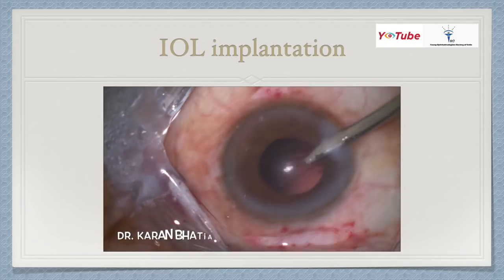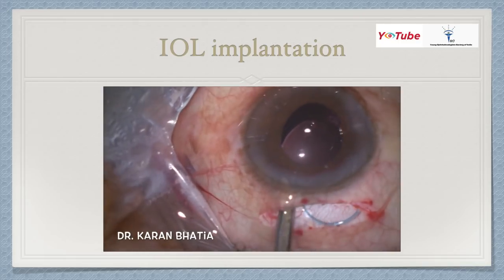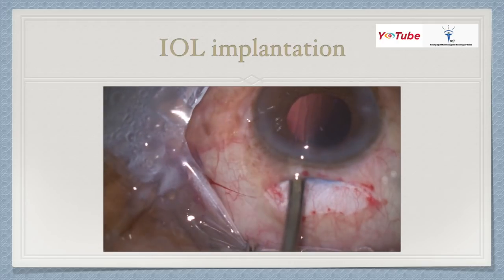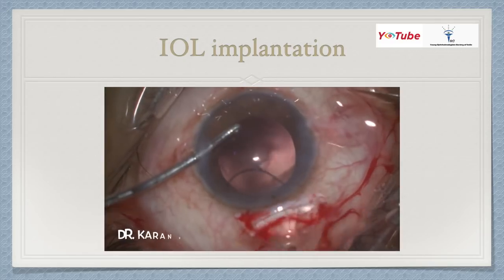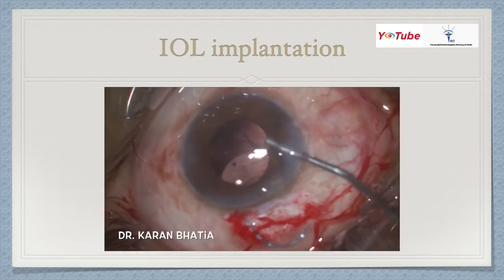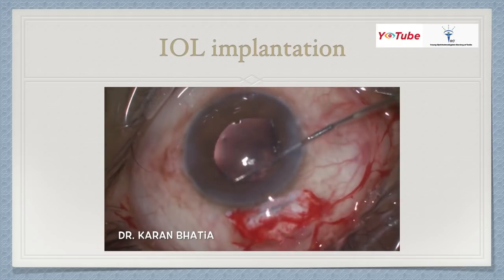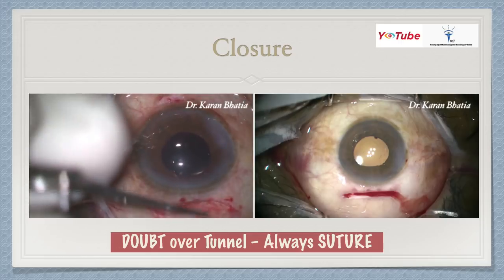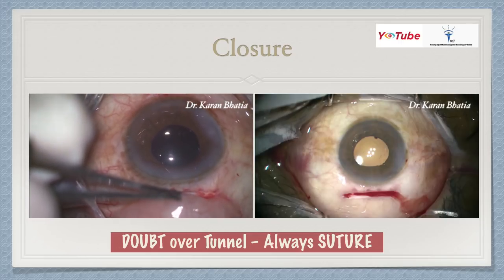In another video, using a Simcoe cannula as an AC maintainer, if there's difficulty placing the IOL, use the dialer hook at the holes or the optic-haptic junction to guide it into the bag. Using the irrigation part of a bimanual IA apparatus, if there's difficulty, always inject OVD inside — it makes surgery so much easier. For initial cases, always do IOL implantation under viscoelastic. If the AC is shallow, inject viscoelastic again — there's no harm in doing so repeatedly. Remember: you can work comfortably in a deep anterior chamber, but a shallow anterior chamber can lead to devastating complications.